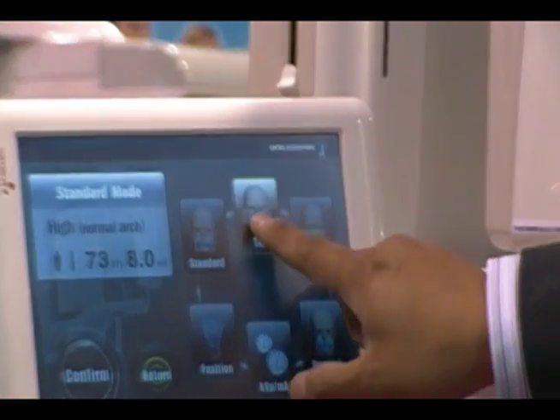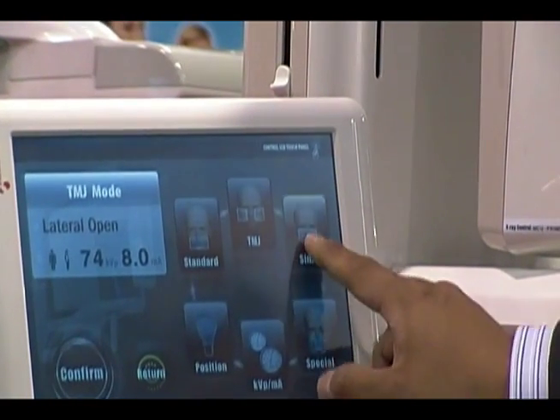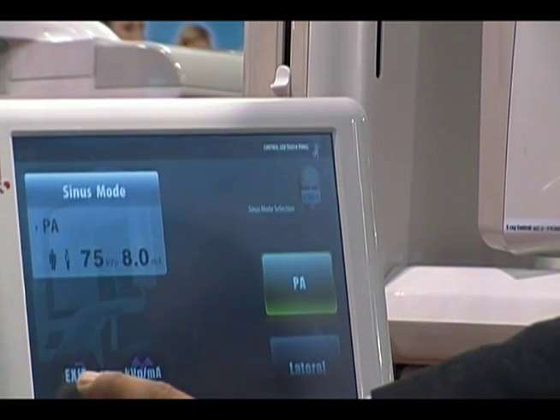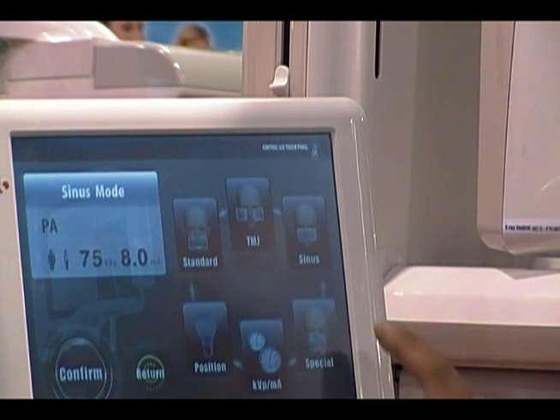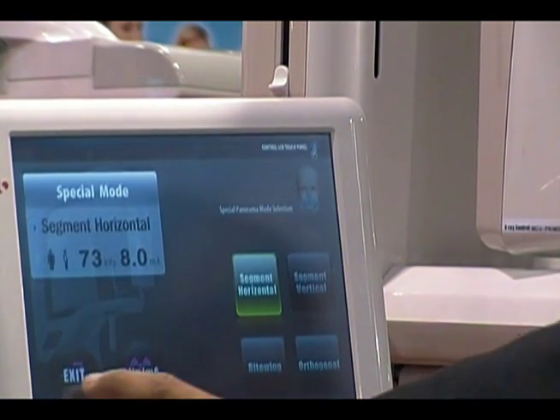We also have a couple of specialty modes: TMJ, and along with TMJ, we also do a sinus scan. We also have a specialty screen where we can do bite wings and orthogonal cuts.